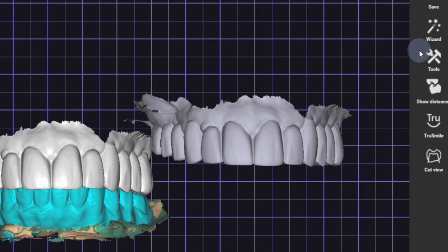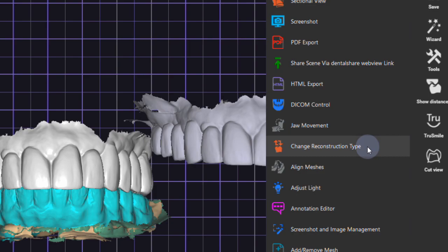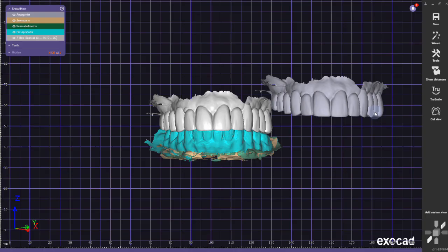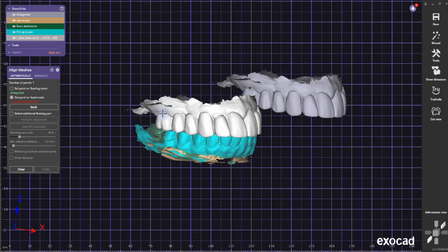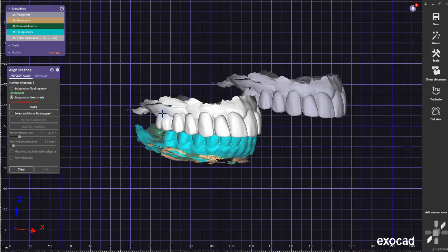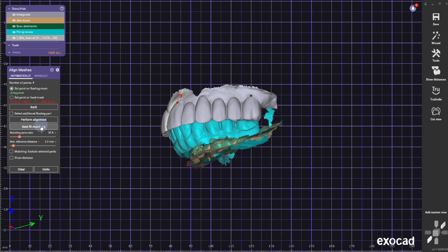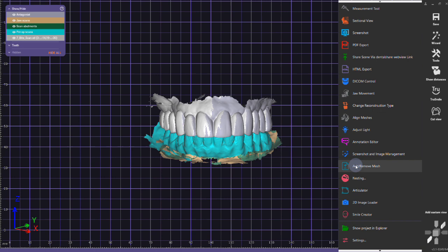And now I can do the upper. Again, align meshes, find enough reference points you have so you have a good alignment available. And once you're done, you can get out there.